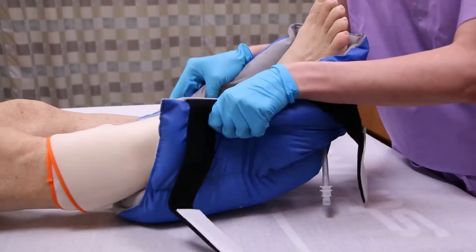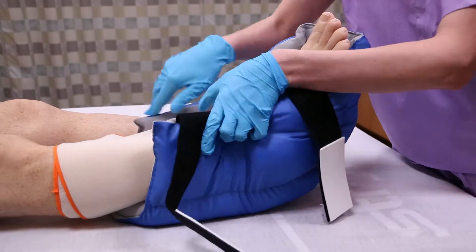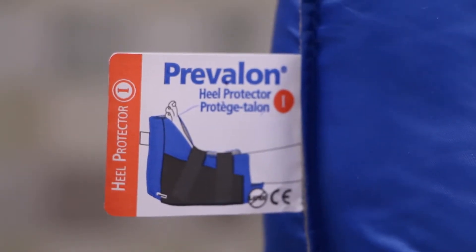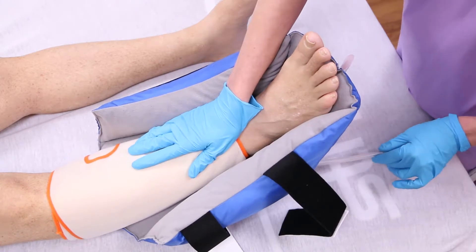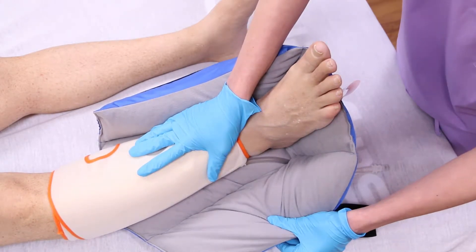Next, pull the sides up around the foot and toes, ankle, and lower leg. If the tag is visible, it is on correctly. Check any tubing to make sure it's not kinked or bent. Also, make sure it is positioned away from the skin.